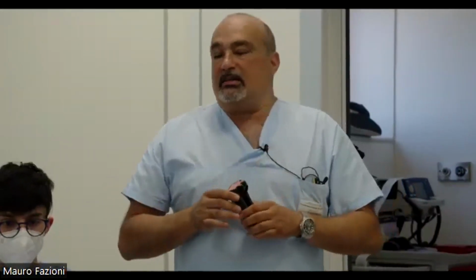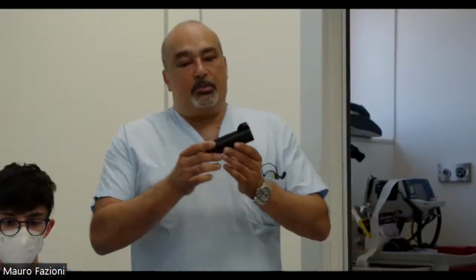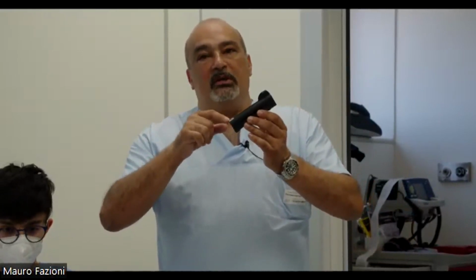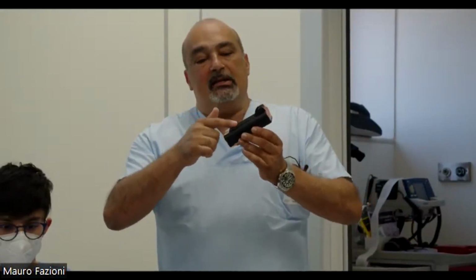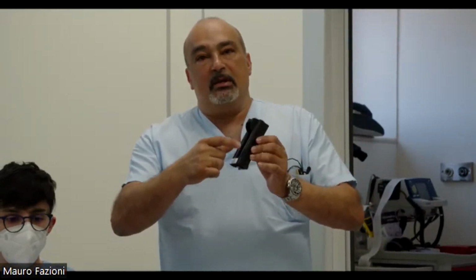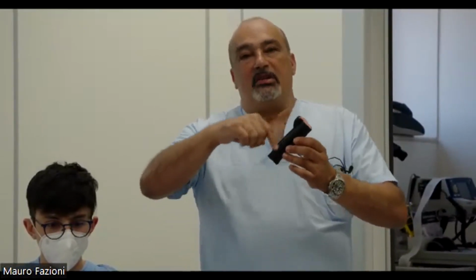So the guys from DVS thought about this possibility to use this cartridge with 40 degrees and two different materials in two different places. They are squeezed into the base, and there is a circle.